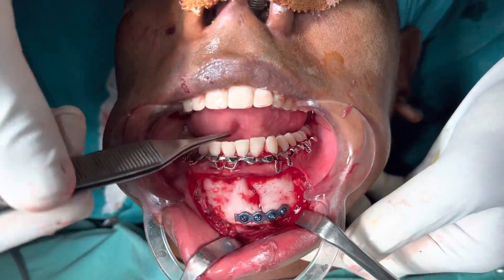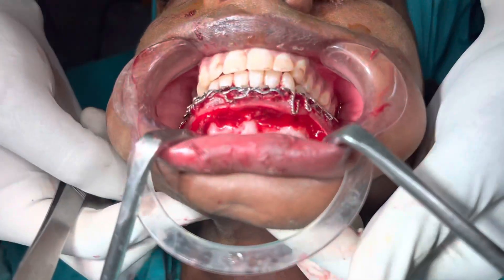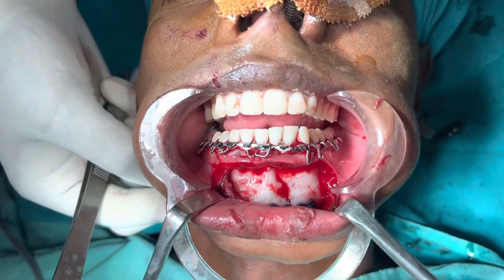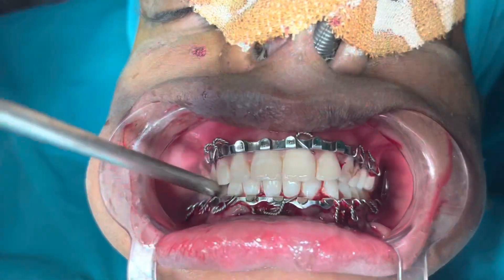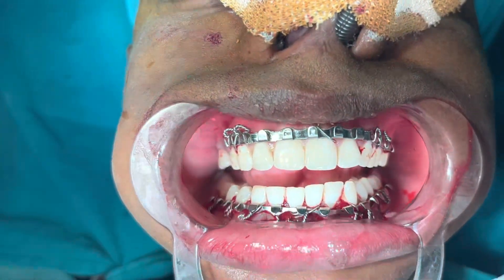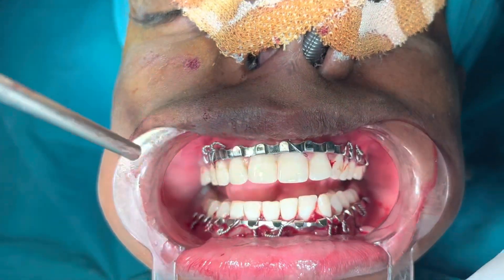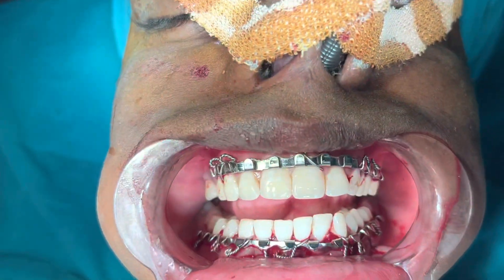You can see the occlusion — we've got perfect occlusion. We've now completed the procedure and switched it up. You can see perfect occlusion. We have arch bars in both jaws because we want to use elastics later on, as the patient has an undisplaced fracture of the condylar head on one side. The occlusion is really good now — as you can see, it's perfect.